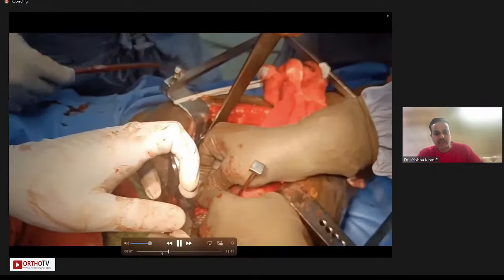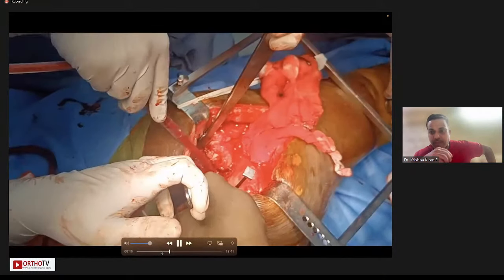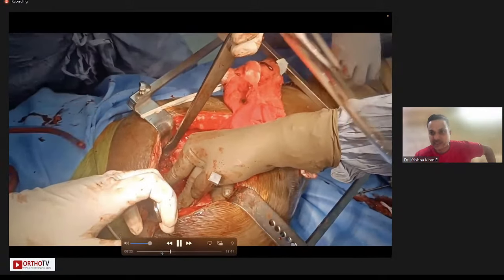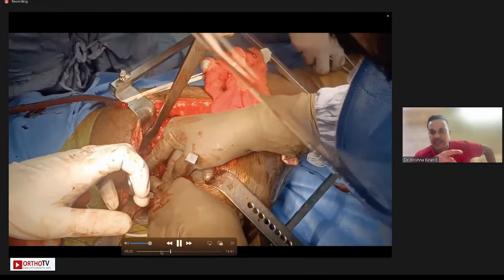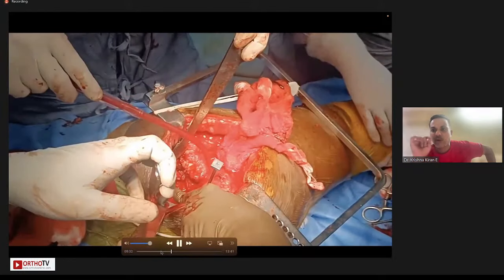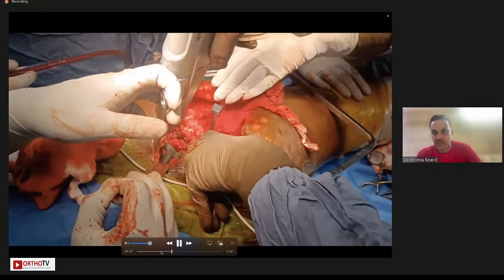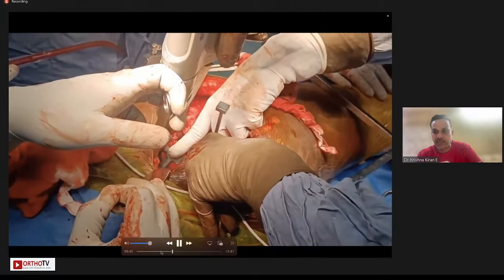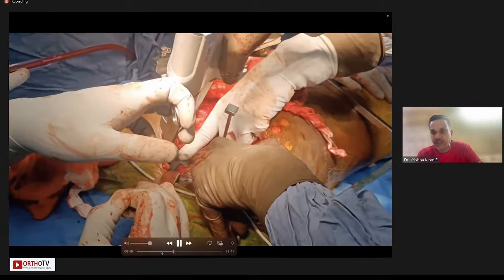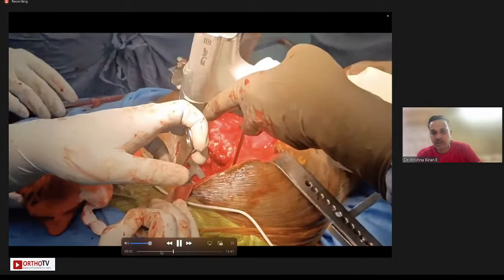So the question again comes is whether we need to put the augment first or we need to put the cup first. So wherever we are using the augment for primary stability, because you do not have primary stability with the socket itself, the augment is going in first. So the augment goes in first. You stabilize the augment with a couple of screws, but we have already done the AP capture point and determined what will be the provisional size of the socket. So suppose you have reamed till 60 and you think that 60 is the size of the socket. Now you use this augment, you fix the augment in the periphery. You can use a trial cup or a reamer, the last reamer, as a template for this augment so that the augment doesn't over constrain or come into the acetabulum and then make it smaller or narrower.